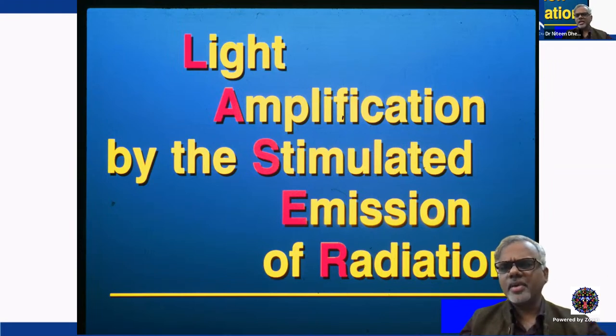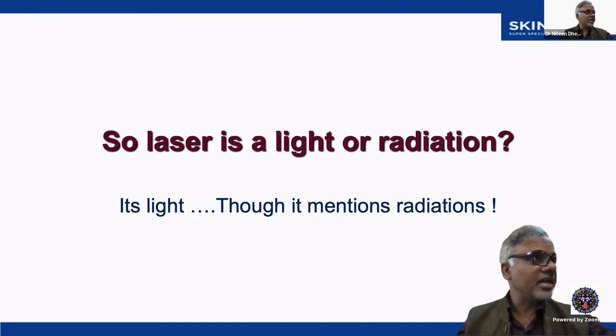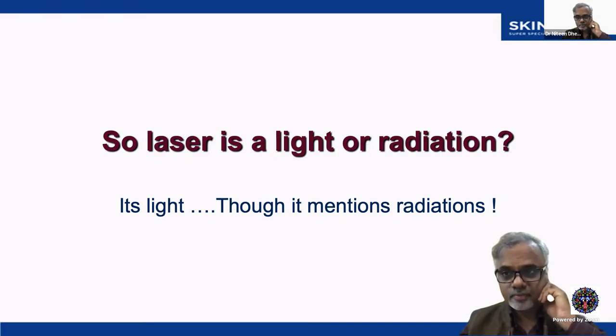So the first layman's question: can lasers cause cancer? No. Why? Because lasers are not ionizing radiations. Those are non-ionizing radiations. Ionizing radiations can cause cancer, but not light. Laser is basically light. The basic component of laser is light, and that is a photon. So all the physics applied is the photon physics or the light physics.